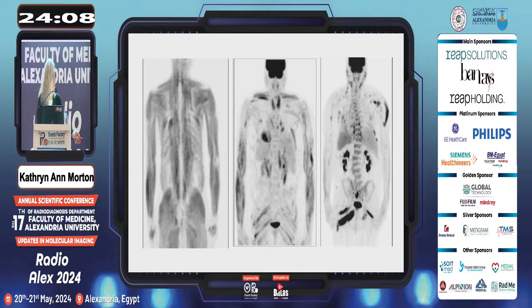The patient on the right had multiple metastases to skeletal muscle. And I don't know that you would know this specifically other than the fact that there are a lot of lymph nodes in this patient as well.